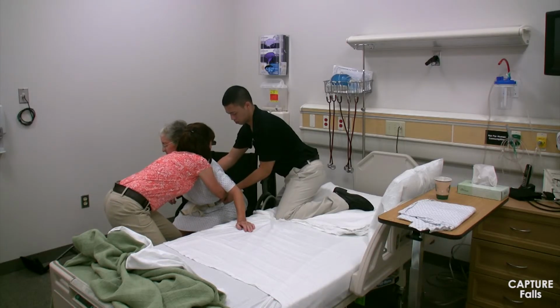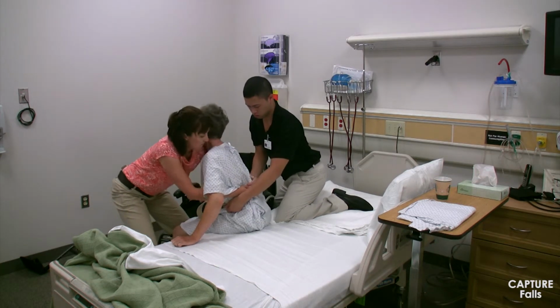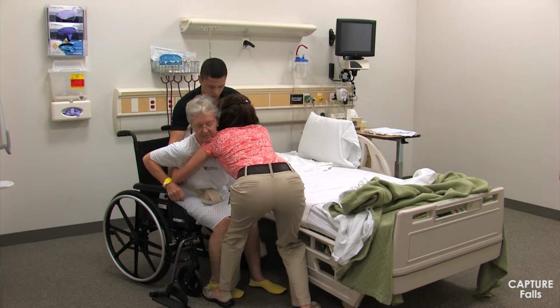At the same time, rock your body weight back onto your back leg to use your body weight to assist the patient in unweighting her hips. Once the patient's hips are raised off the chair, you can then pivot with the patient to assist her towards the bed. Don't simply pull up on the gait belt. This is uncomfortable for the patient and increases your risk for back injury. Keep your grip on the gait belt and use the transfer of the weight of your body onto your back foot to shift the patient's weight off of her hips and onto her feet.